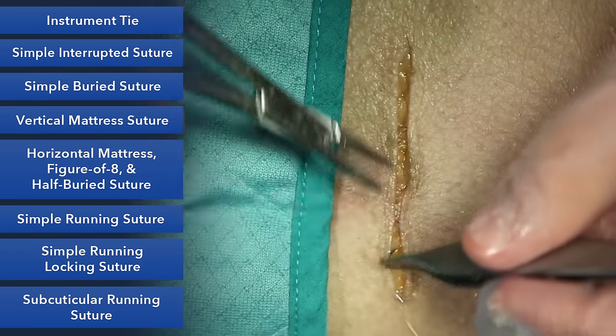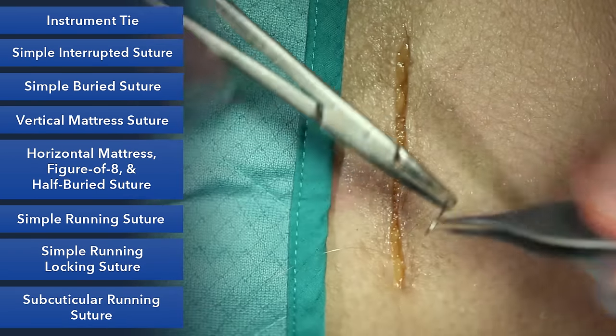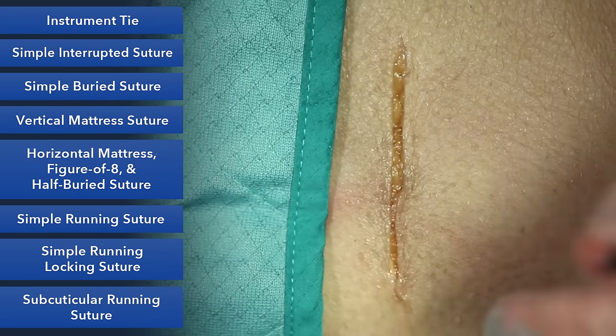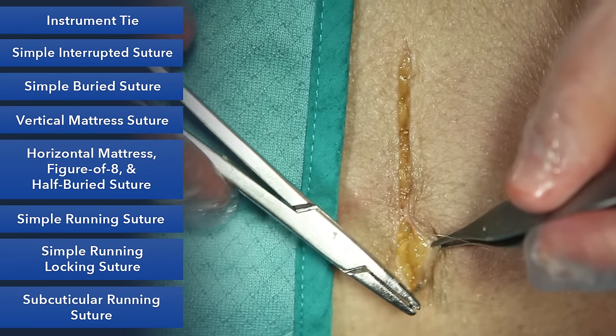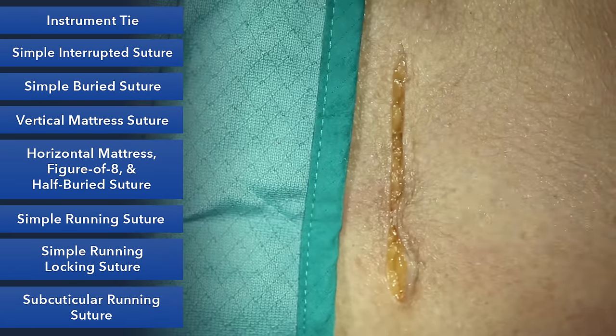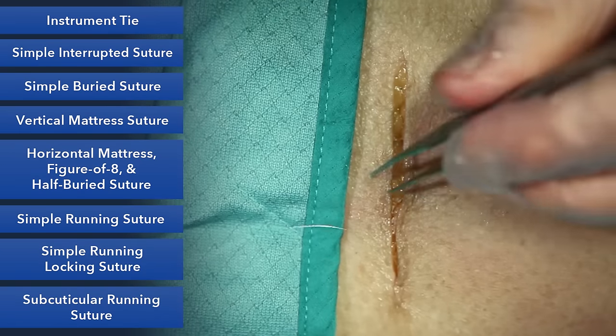Now with this stitch, I'm always asked, how much do you advance each time? What I like to do is just see here with my suture where the next bite should be, and that's where I'm going to put it. So in some sense, it depends on how much tension there is. On this wound, there's not a lot of tension.